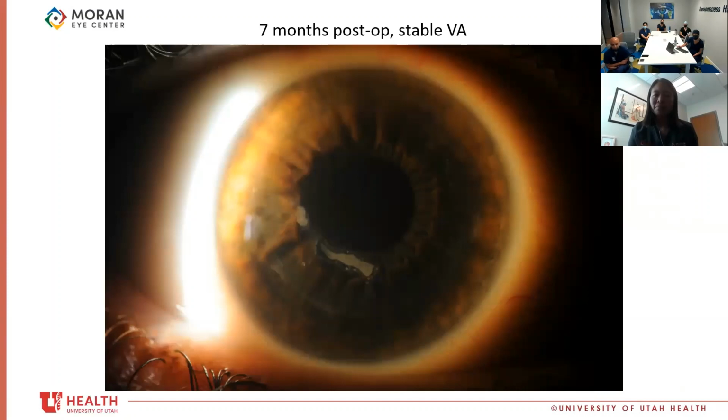Yeah, because one of the things we always monitor in these patients, as you know, is the flap thickness, and see if there's any thinning going on in the areas affected by the growth. But do you think this was a leftover thing, or was it a new growth of cells going in?